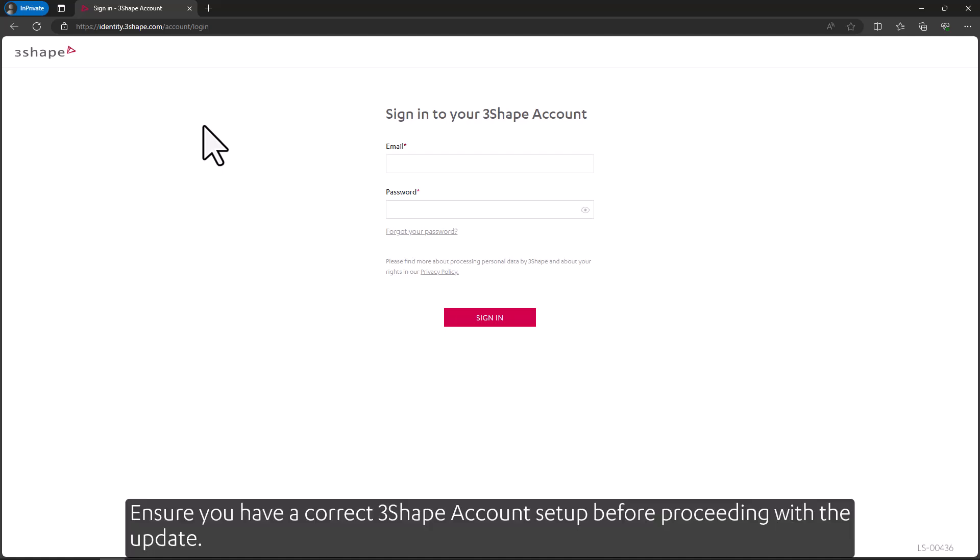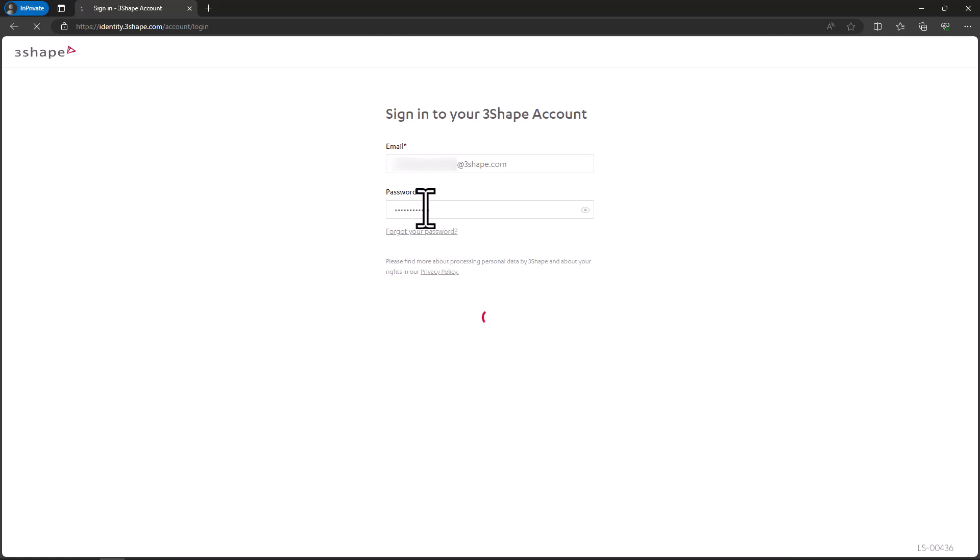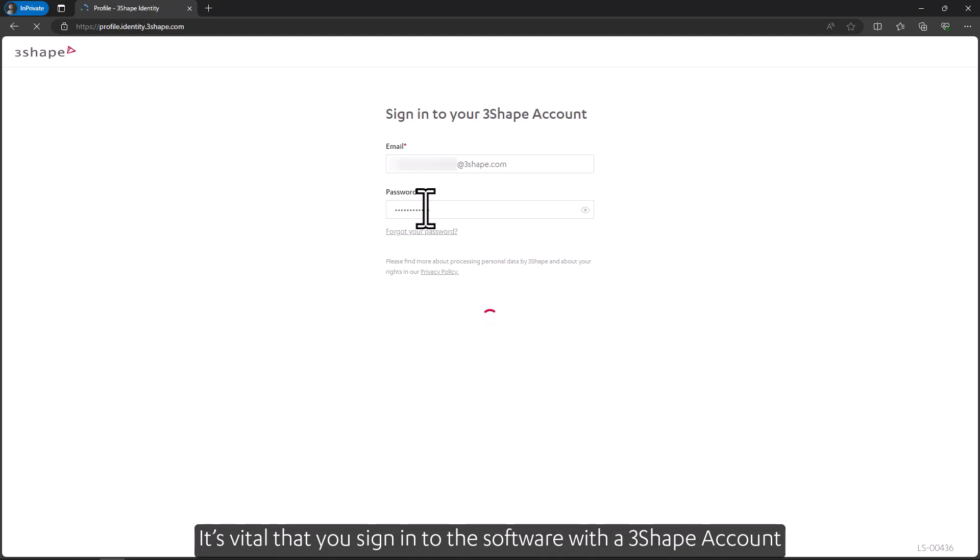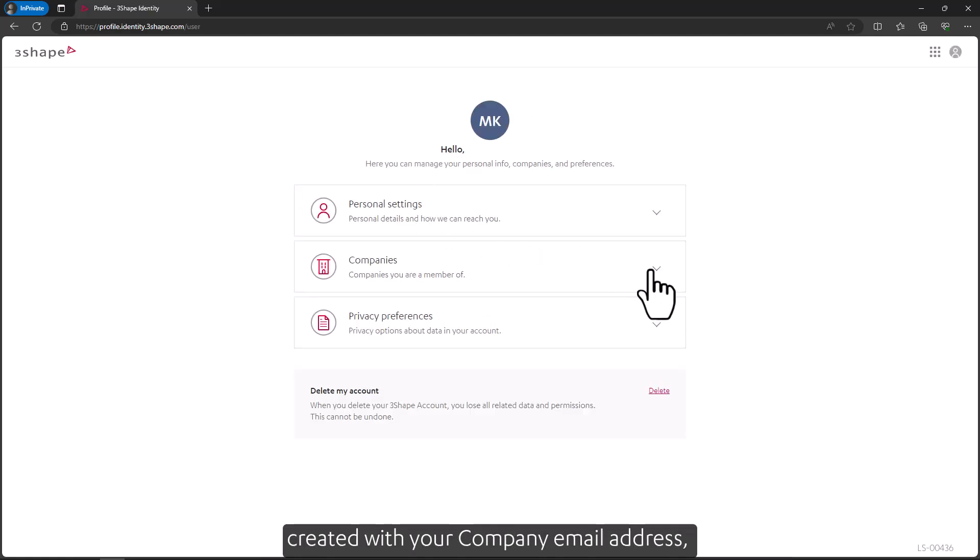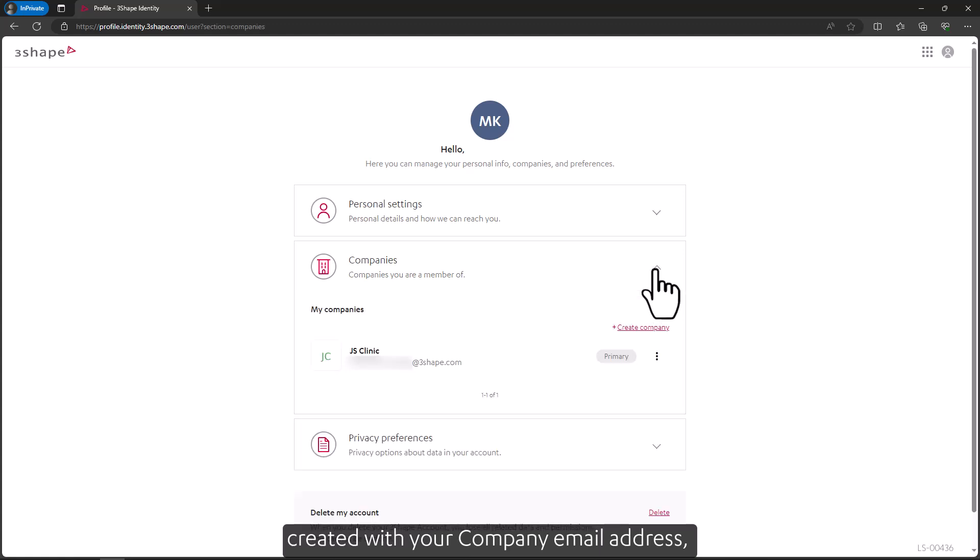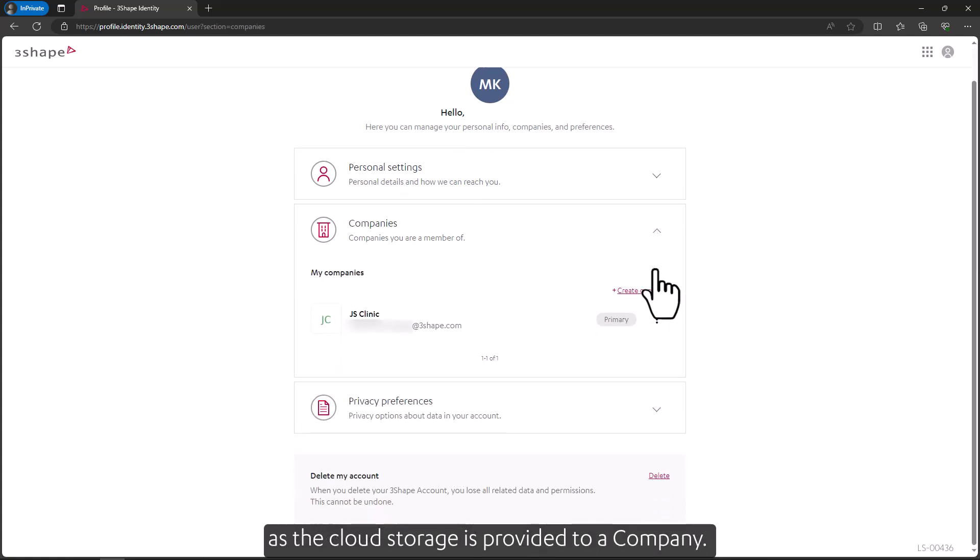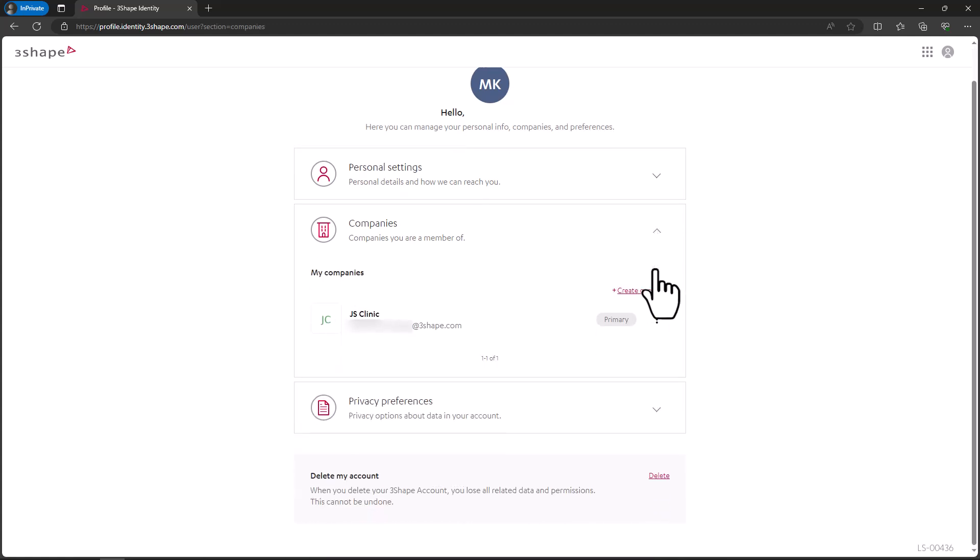Ensure you have a correct 3Shape account set up before proceeding with the update. It's vital that you sign in to the software with a 3Shape account created with your company email address as the cloud storage is provided to a company.